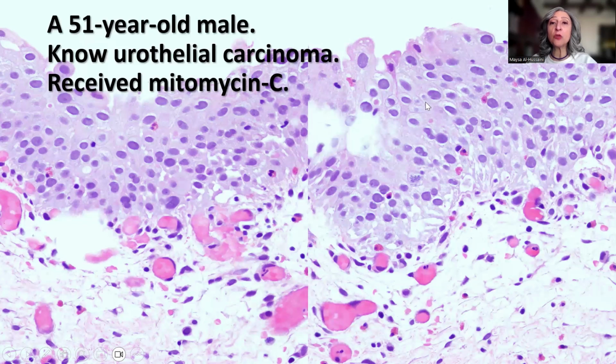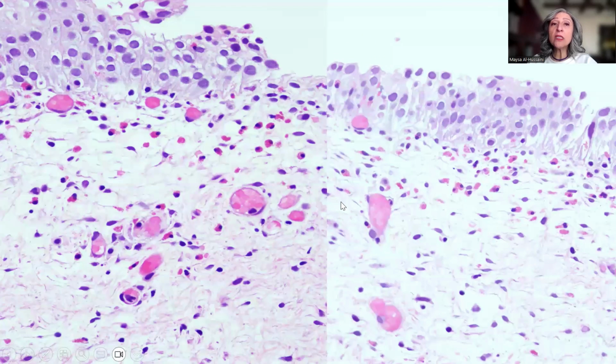But mind please the presence of eosinophils scattered along the different layers of the urothelium. This is another focus, and again you see some loss of the urothelium here, some atypia, loss of polarity, hyperchromasia, irregular shape, wrinkled nuclei, all would really cause some concern whether the patient is now having even worse than the low-grade urothelial carcinoma, whether the patient has carcinoma in situ or at least dysplasia.